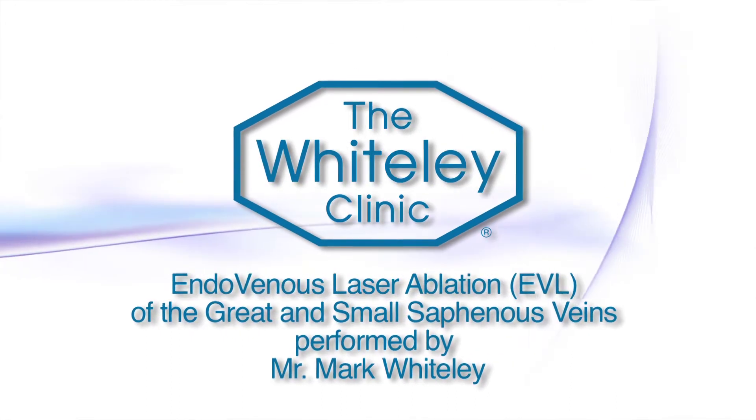The endovenous laser is an excellent technique to use for the local anaesthetic. It's very fast and it also gives very secure closure, provided we get between 60 and 80 joules per centimetre all the way down. It's called the LEED, which is basically the linear energy density within the vein.